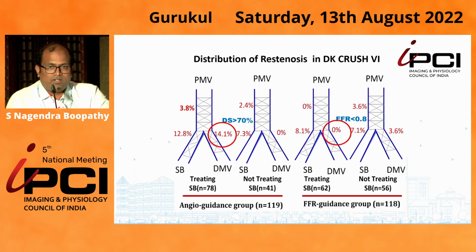This is a very, very important point. Basically, we are converting a provisional stent strategy into a two-stent strategy based on some side branch issues. So if we identify those lesions, there are true bifurcation lesions. At that point of time, the DEFINITION strategy was not available. So these are all very complex bifurcation lesions. Maybe upfront they should have gone for a two-stent strategy, which was not the question put forth in front of them. So this is an important point to be remembered.